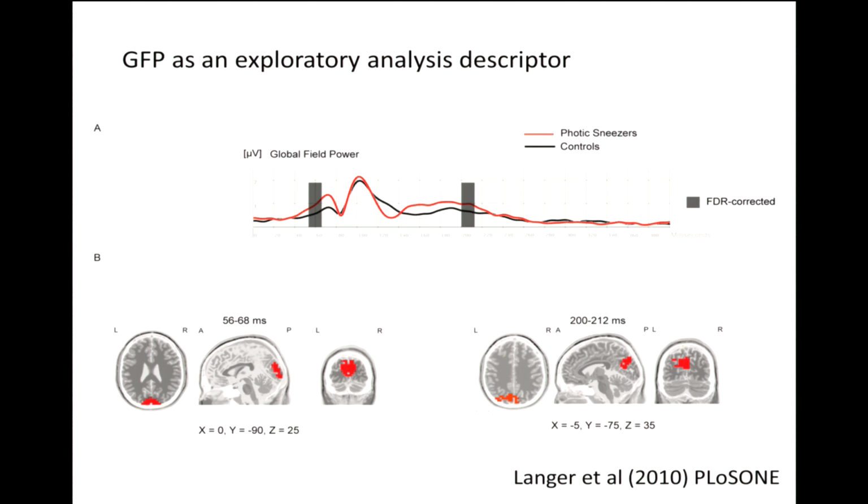And then after applying source reconstruction, which we will cover a bit later on, they found that the activity differences between the two groups are represented in these brain regions. Details are not important where it is. Similarly, you can apply source reconstruction at this later stage, and other brain regions come up showing different activities.